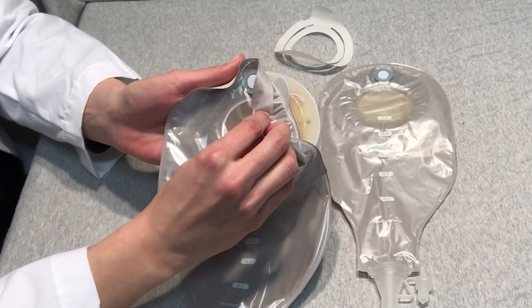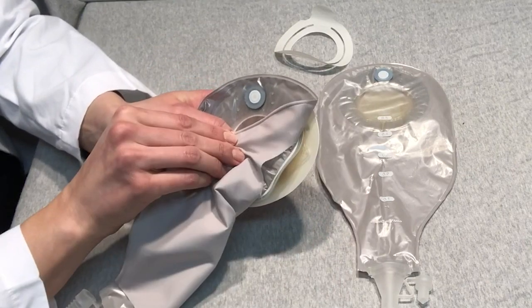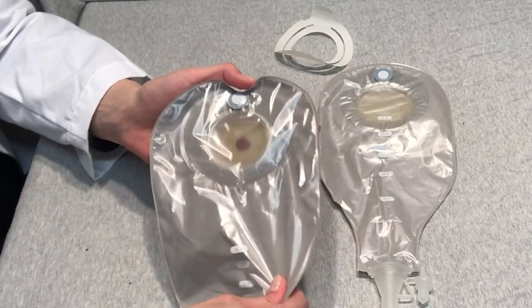You want to make sure that you have a good seal all the way around and you can also give it a good tug to make sure it's on there.